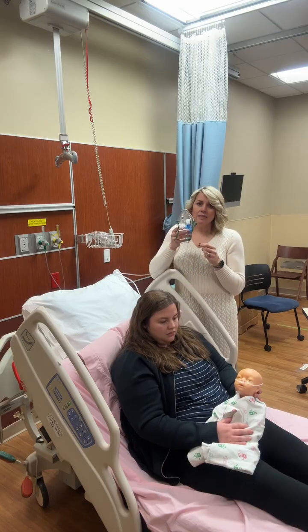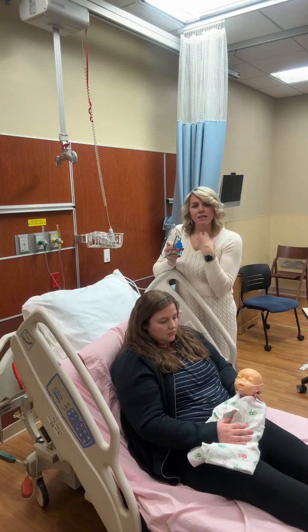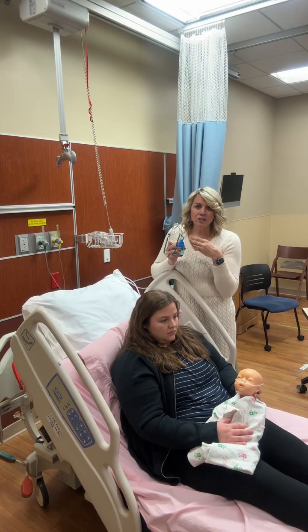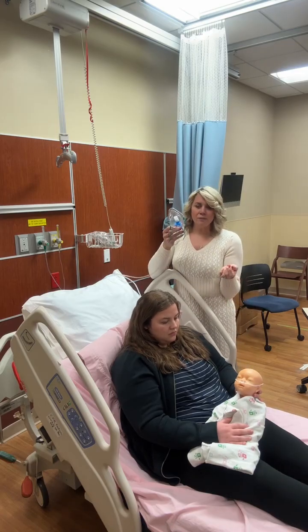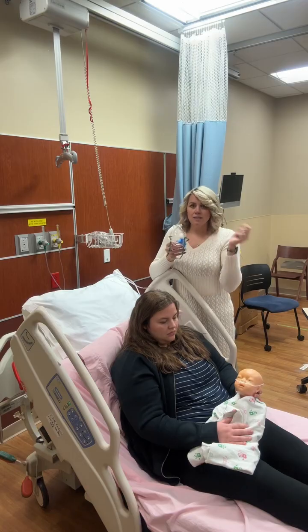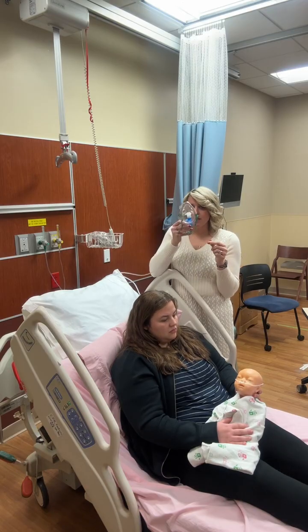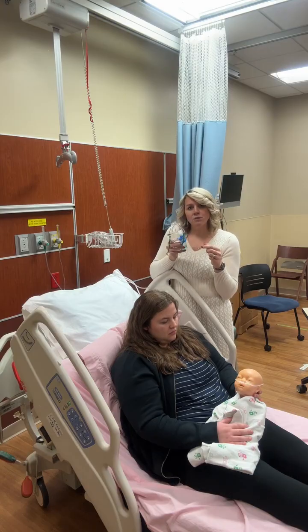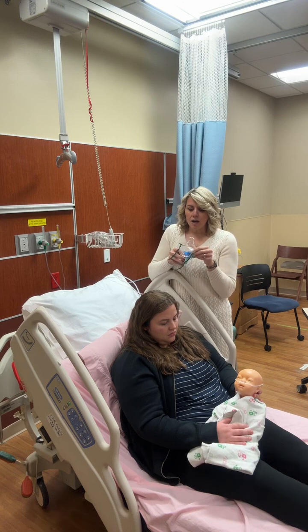So putting a mask on could alter or inhibit us from getting into the mouth and clearing the secretions in the vomit. And in that situation, that's going to become a safety concern for the baby to aspirate. Also, we're going to be interrupting the nebulizer administration over and over by sucking the baby out nonstop with a bulb syringe in the situation that we use a mask. So a mask would not be appropriate in this situation for an infant.